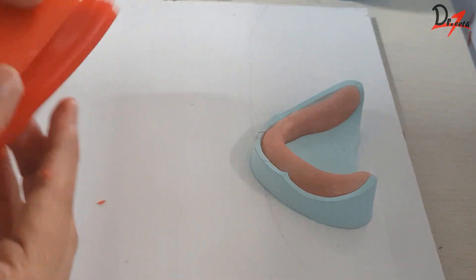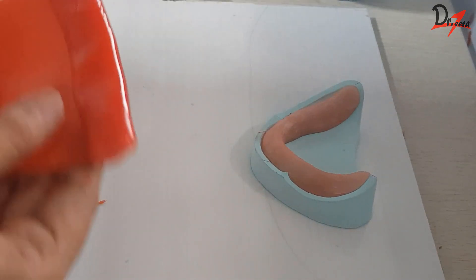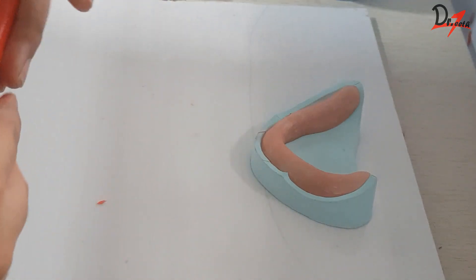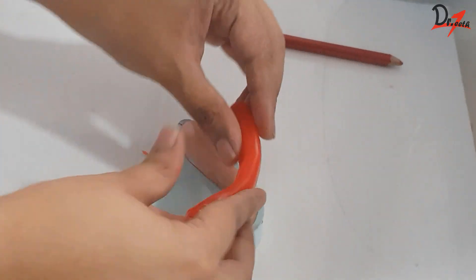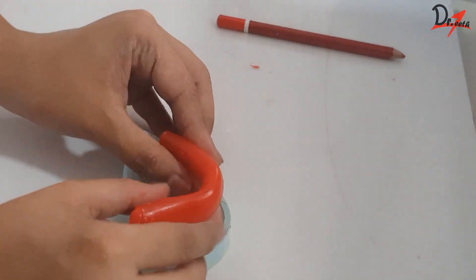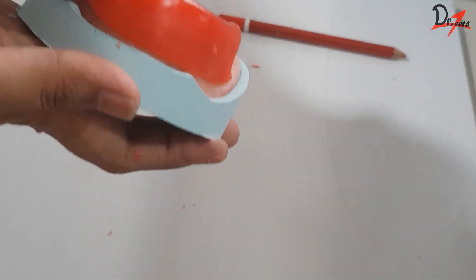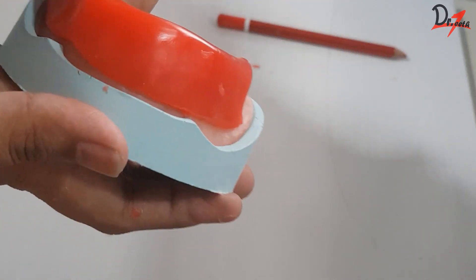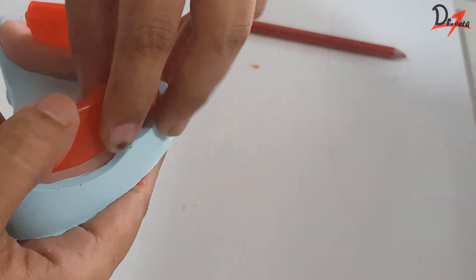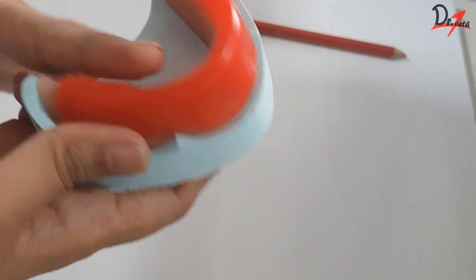Once I'm satisfied with the thickness of the wax block, I'm going to make a U shape and adapt it onto the mandibular cast as you can see here. We have to make sure that the rim follows the arch form. Now what I'm doing is adapting the modeling wax like so — I'm just pushing it into the sulcus while maintaining the shape.